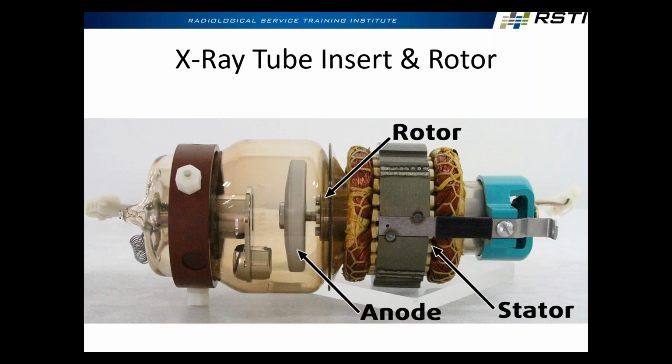Yeah, well, in general, the more penetration we have up there, the less absorption and scatter we have. So it's about attempting to reduce the amount of scatter that's being produced by the subject, because anytime X-rays encounter matter, you're going to get penetration, you're going to get absorption, you're going to get scatter. It's just the way it is. I don't care if you're shooting a block of lead. Lead is what we use as a medium to prevent the passage of X-rays, right? But when those X-rays hit that lead, they're still making scatter. So we just want the hardest part of the beam up there.